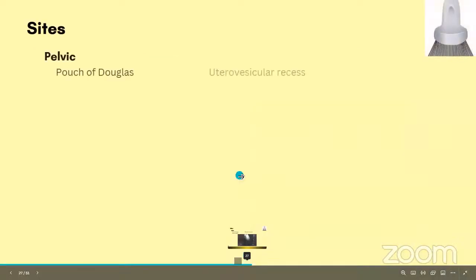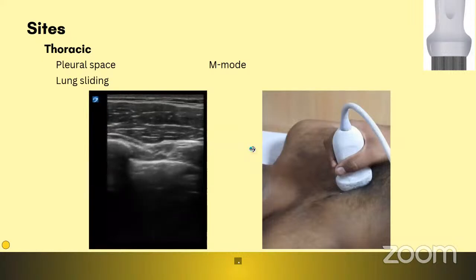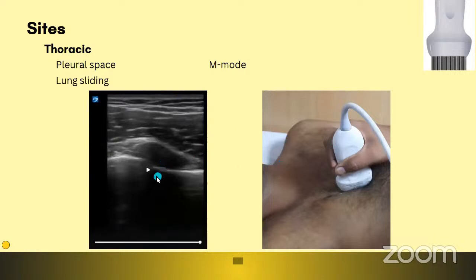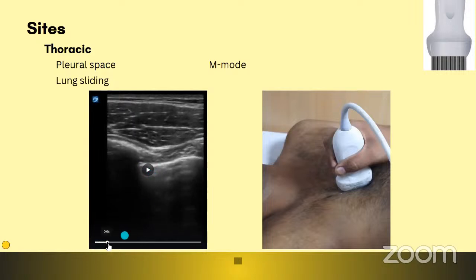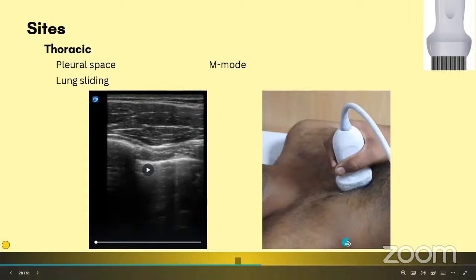Fine. Now, moving on. Next and final component of eFAST. So FAST plus the extension of thoracic cavity, eFAST. We are going to see the pleural movements basically. That's what we are actually interested in, because what are the most common conditions to be seen in lungs whenever we use ultrasound? Possibly pneumothorax or lung collapse or pleural effusion, etc. In all these cases, and more specifically pneumothorax, since air is much lighter, it would just come and get accumulated in the anterior area.